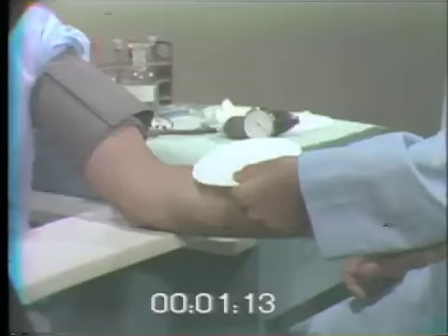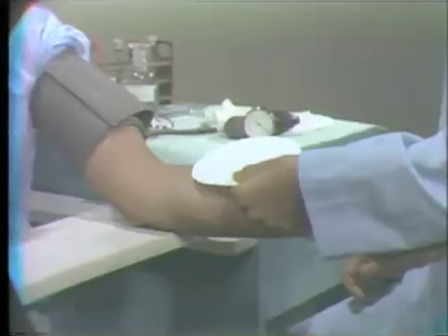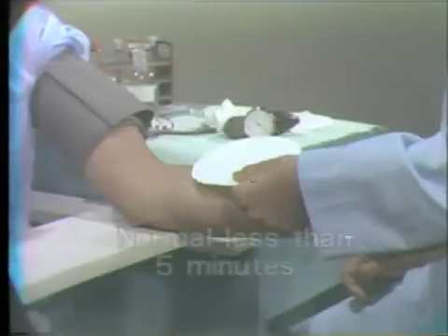This concludes the test. We would stop the stopwatch. The normal values are under 5 minutes. The normal range is 1 to 9 minutes. Most people will usually stop bleeding within 1.5 minutes to 2 minutes.